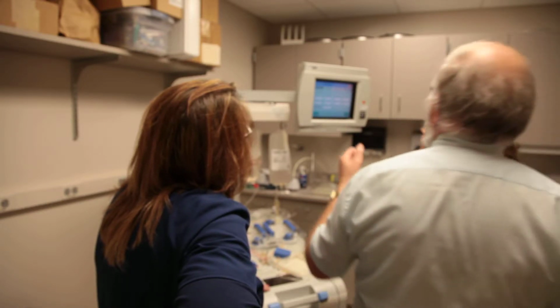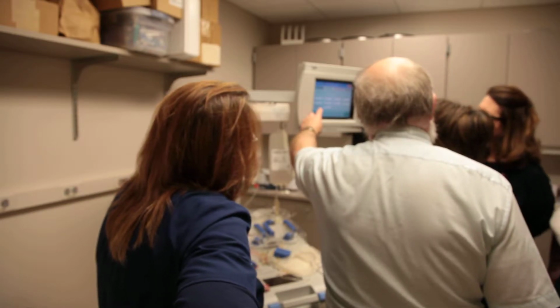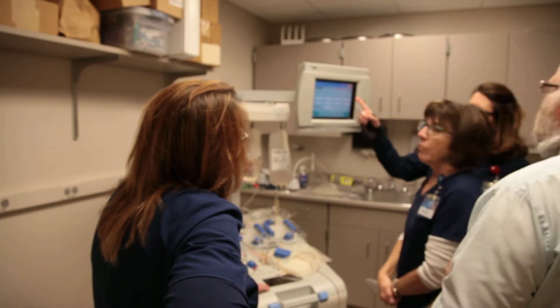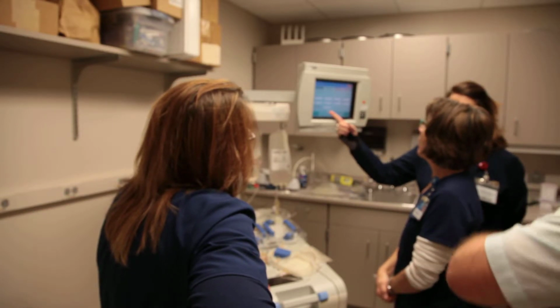Okay, we must have missed it. If it's small enough, it will tell you that you need a custom prime. It knows, because normally this is defaulted to no. It did pop up custom prime, but yeah, we didn't point this out. This would say yes, and reinfusion should say no then, okay.